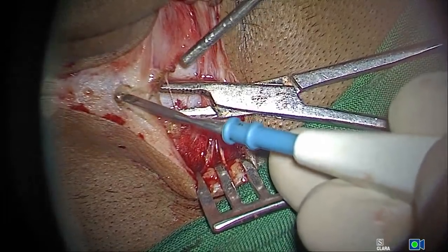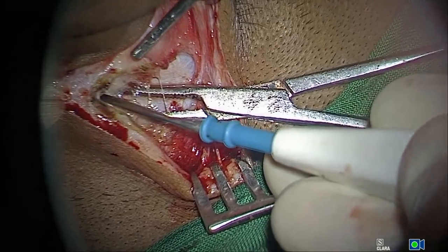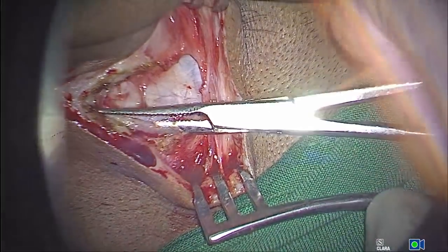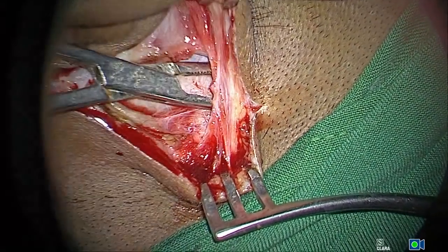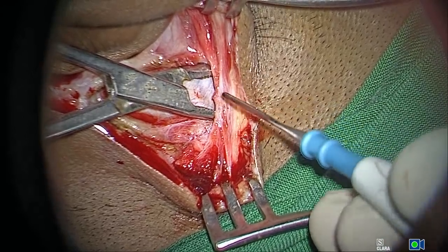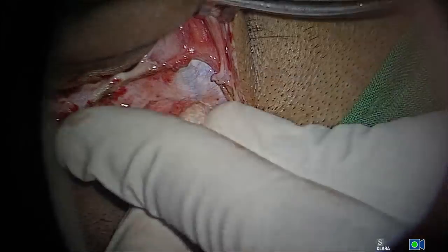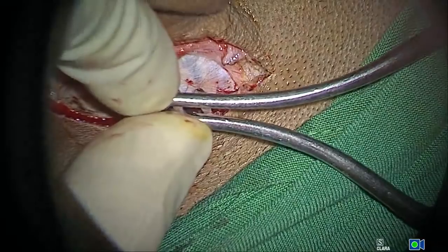Dr. Rajesh, this is a case of an anterior central perforation. The patient has had a discharge for the past 2 years. So this is a case of a central perforation with a 40 decibel hearing loss. You can see that now the graft layer is clearly seen.